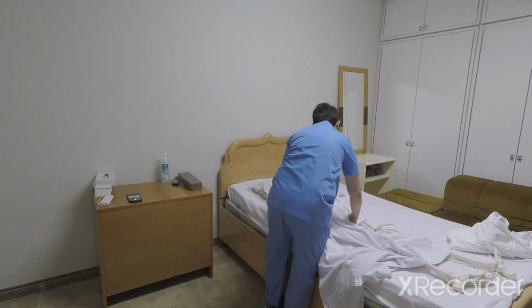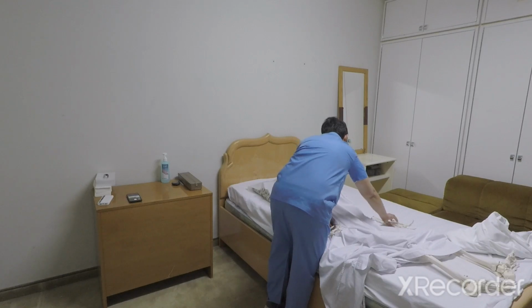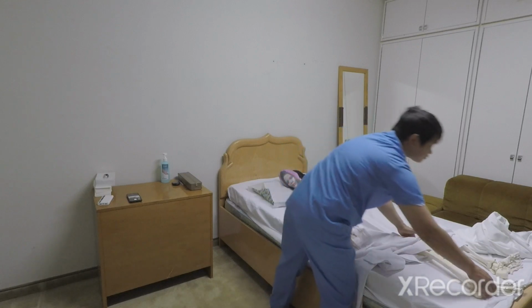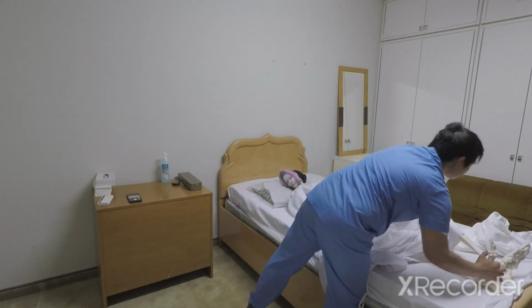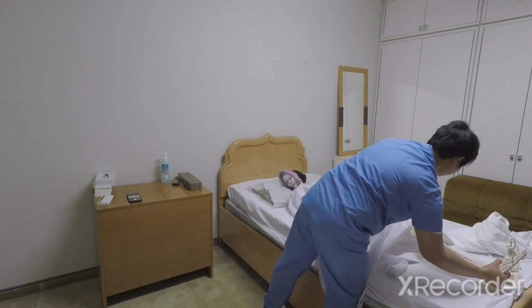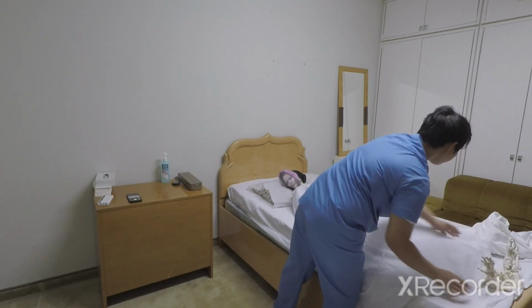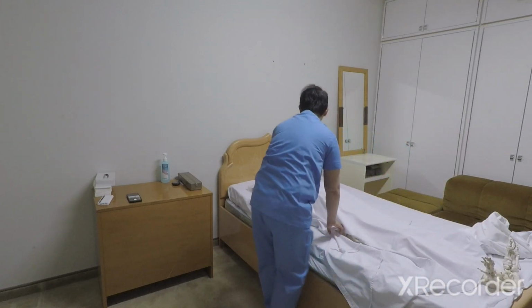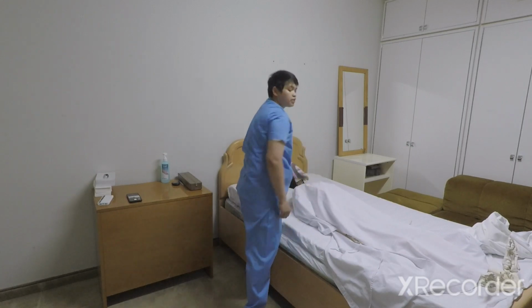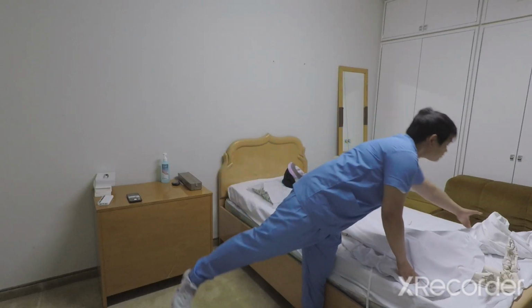Ask her, if she can move, to move a little bit to the side. Then, help her with the head. Now, that's our transfer to bed.